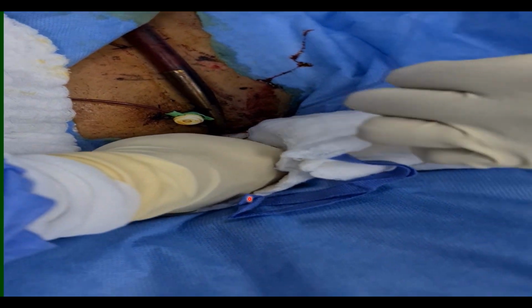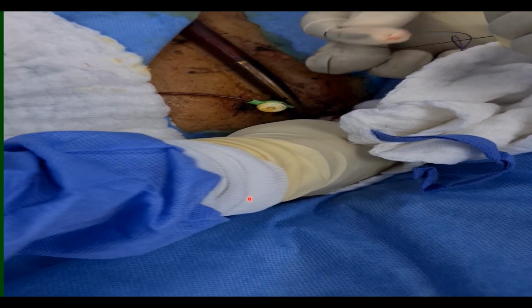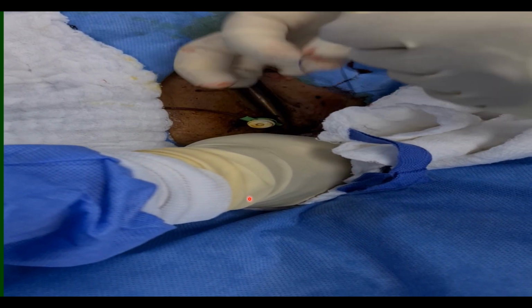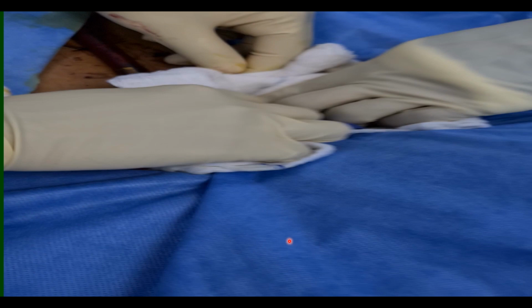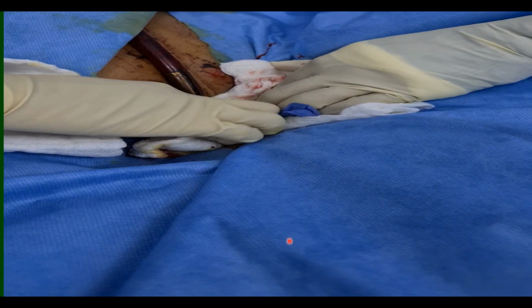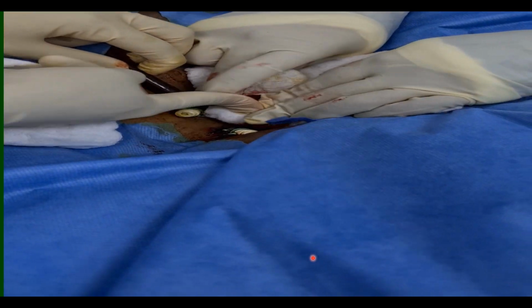Now they compress firmly, one compressing with his hand and the other tightening the sutures to avoid any bleeding or hematoma at the site of removal of this cannula. He will keep compressing for a time. One of them compresses until he is sure that there is no bleeding and it fits very well. Still compressing, and then they will start to remove the second one.